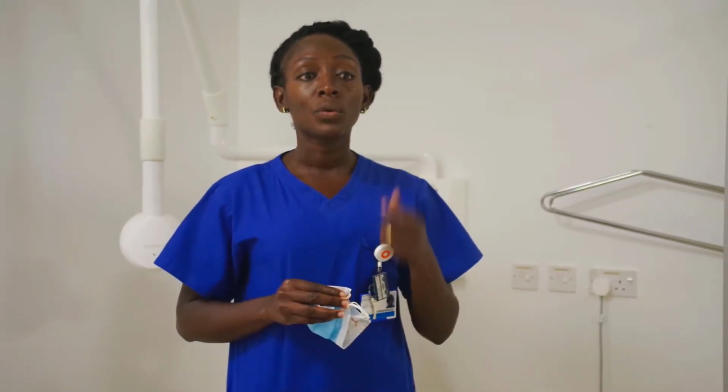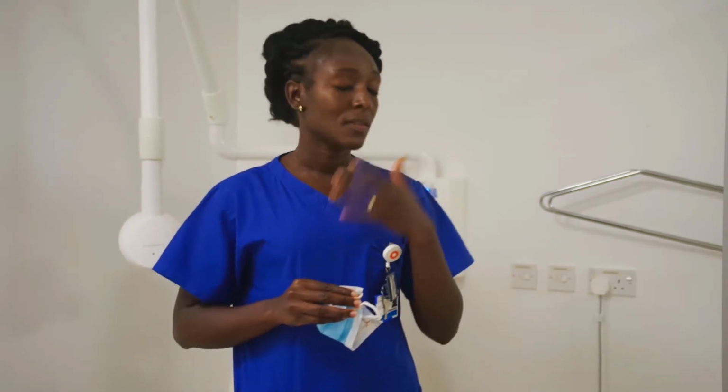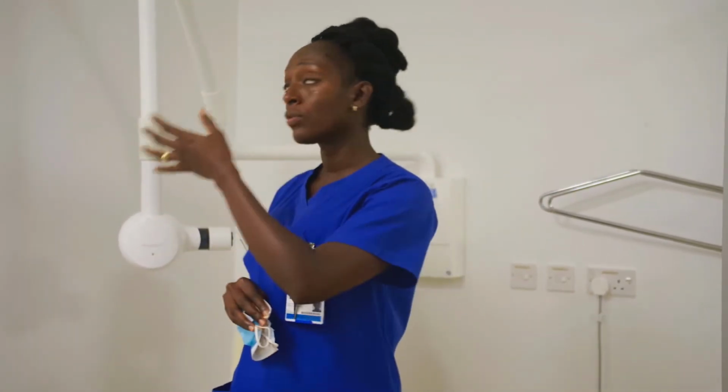But to get the best quality radiograph, some of the things that you'd have to do, one is training. So basically we are training you so that you'd be able to get the best quality radiograph using the lowest dose. Also, Sarah went through preparation, and like I said, these things do overlap. So for you to get the best quality radiograph, it means that you have to prepare your patient adequately. You'd want to explain the procedure to them and tell them your expectation. Also, you'd have to position not just your patient, but the extra equipment.